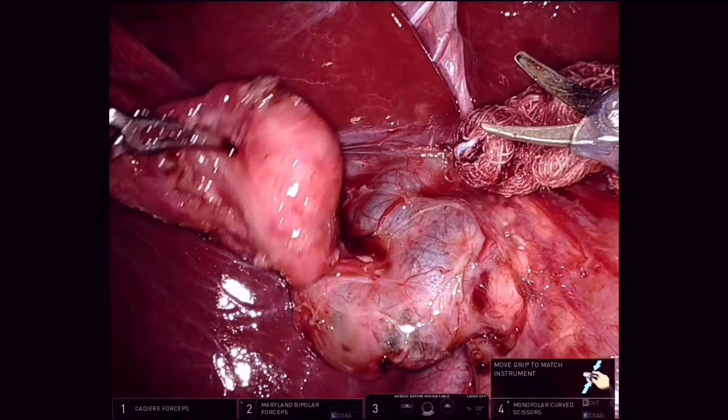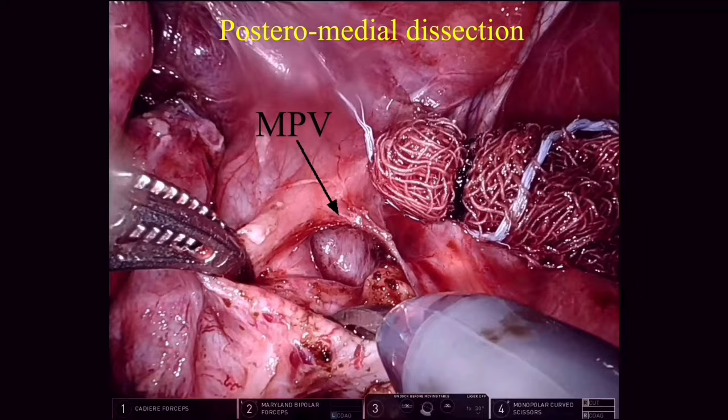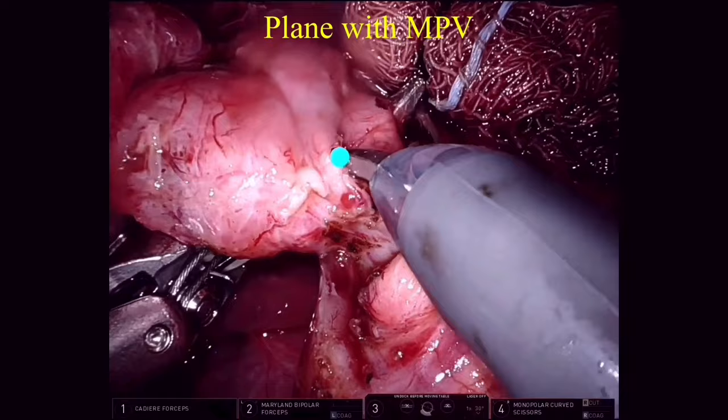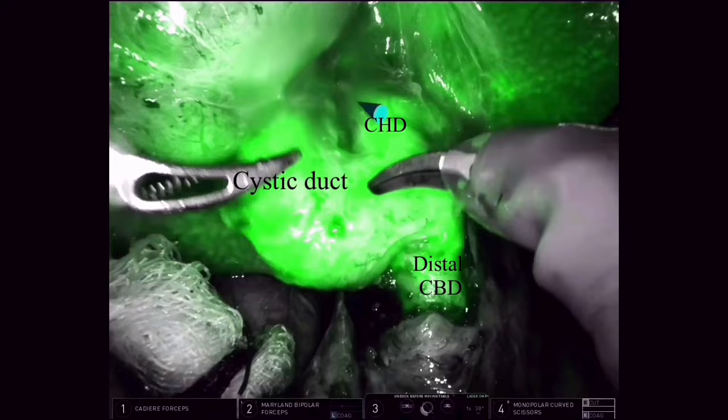The posterior medial dissection is started between the common bile duct and the right hepatic artery. This shows us the main portal vein. We then start dissecting the posterior lateral plane and are able to create the plane between the dilated CBD and the main portal vein. The distal part of the CBD is then dissected into the pancreas. ICG again shows the distal CBD, the cystic duct and the common hepatic duct.